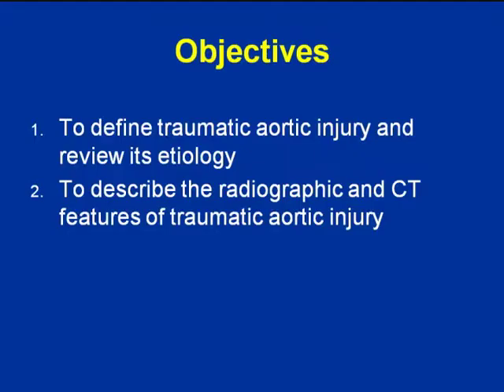So let's talk about traumatic aortic injury. The objectives of this talk are going to be to define traumatic aortic injury and review its etiologies, to describe the radiographic and CT features of traumatic aortic injury. I'm going to talk about both blunt and penetrating aortic injury.